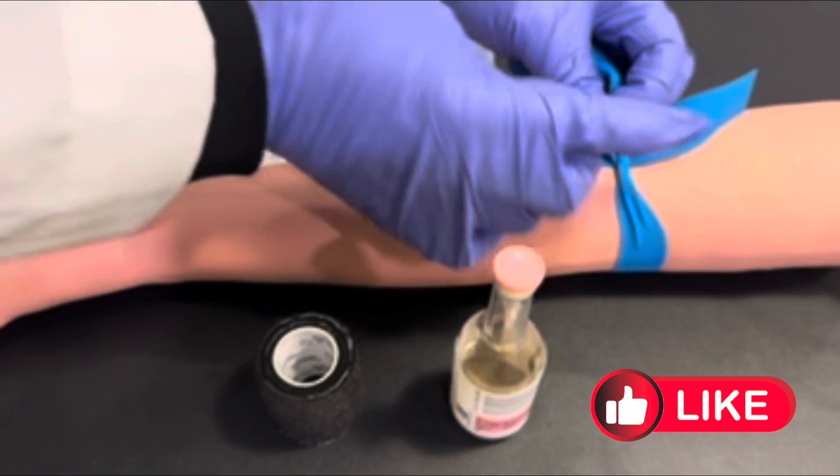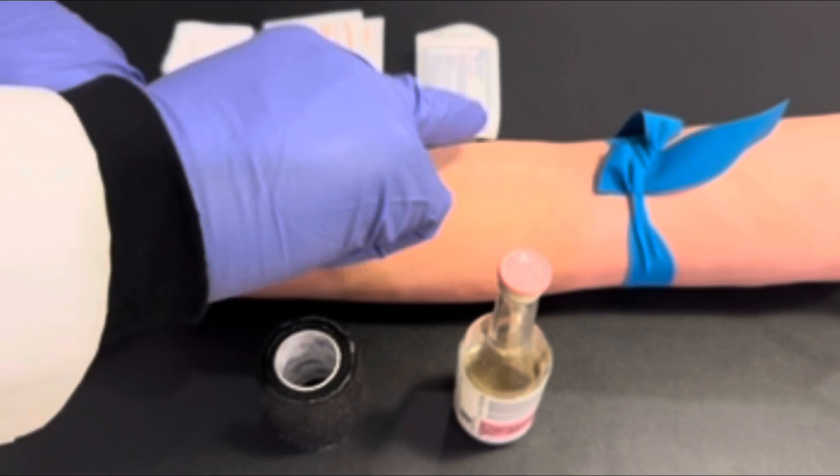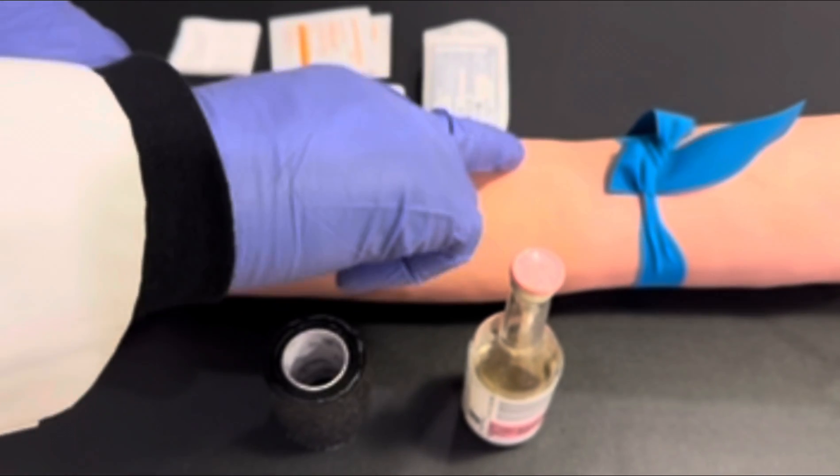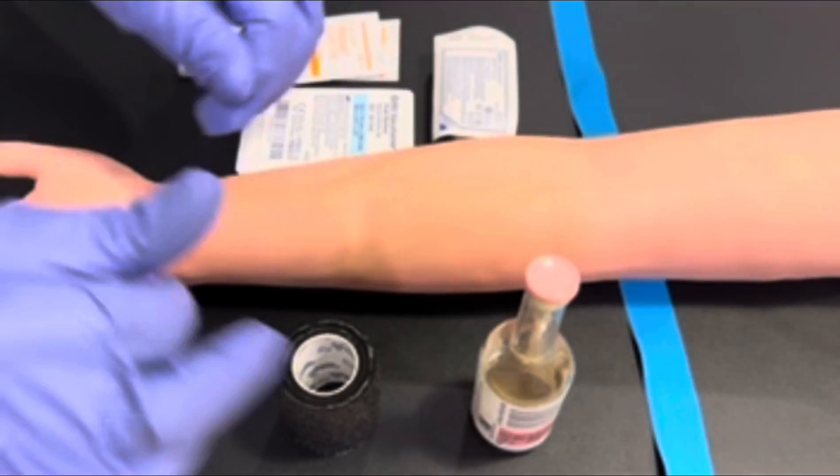First off, we'll start by applying the tourniquet three to four inches above the site of incision. Today we're going to use the antecubital fossa and we will palpate for one of the three primary veins.